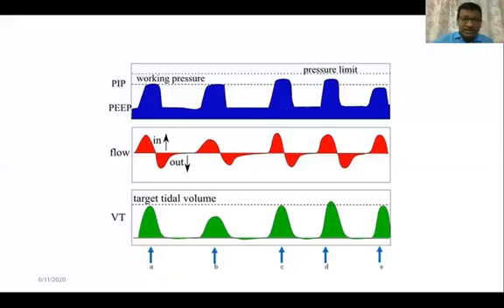Now, look at this slide. Actually, yesterday Dinakar sir called me and told me I should speak something about volume guarantee in graphics, and this is the only relevant slide which I could find, because there won't be any difference in the graphics when you evaluate any baby on conventional ventilation. You need to evaluate graphics in the same way.